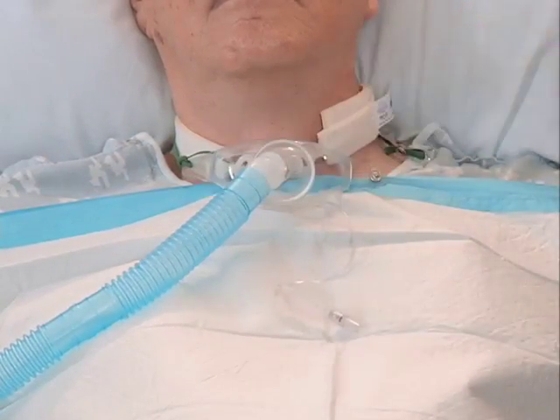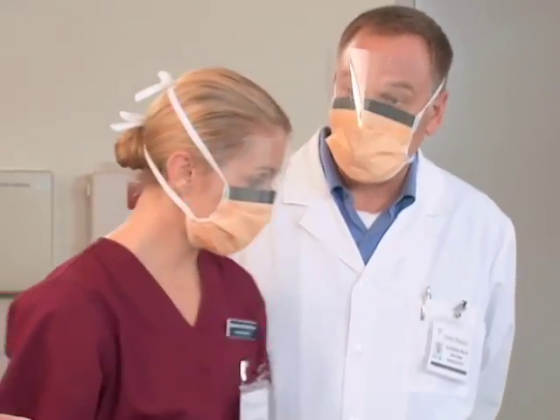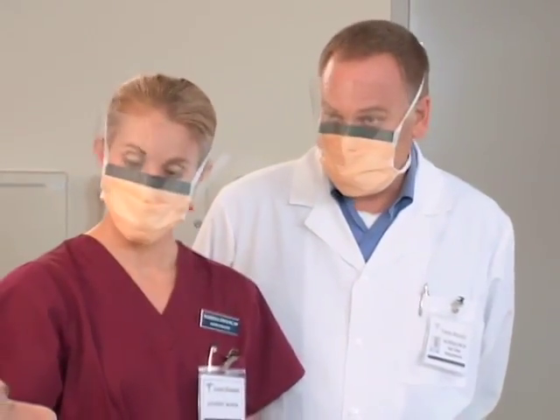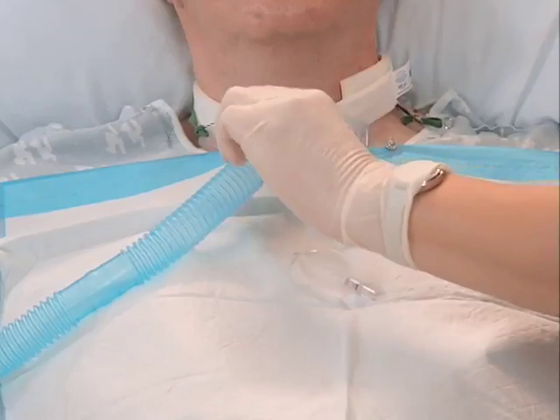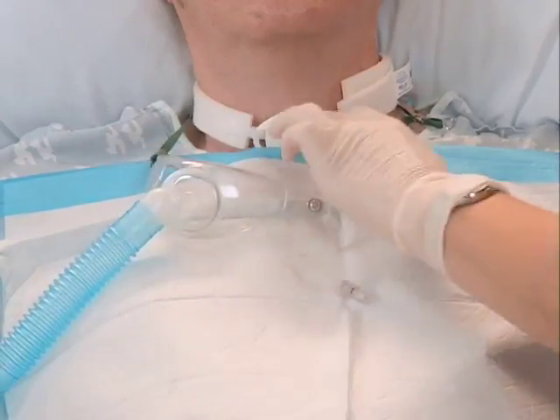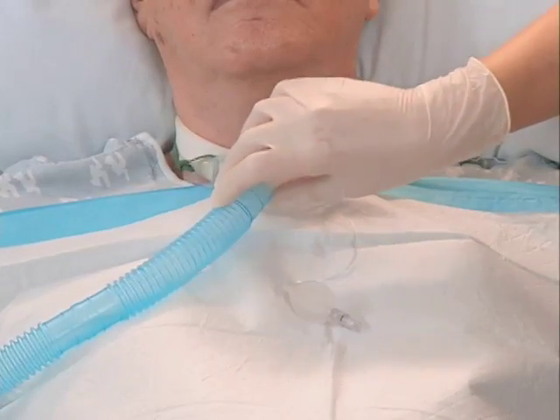Very good, Marissa. Now I'm going to apply a clean dressing and a new collar. Okay, but first, assess the insertion site. Look for any redness or purulent drainage, okay? Okay. It looks good. If either did exist, it may indicate an infection, right?